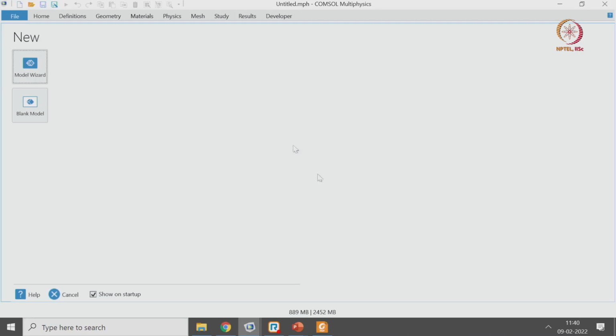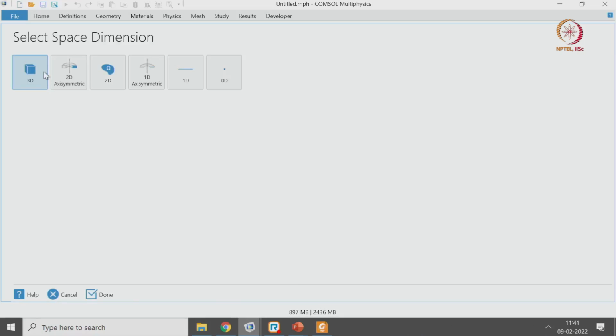This is the first thing that you see once you open COMSOL. You just need to go to File, New, and then there are two options. One of them is Model Wizard, and it is best to use the Model Wizard instead of going to a blank model. Once you click on Model Wizard, there are different dimension options you can choose from. For example, you can choose a 3D simulation, a 2D axisymmetric, 2D, 1D axisymmetric, 1D or 0D.